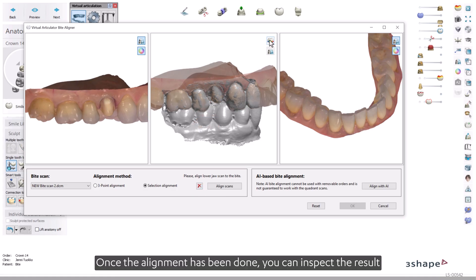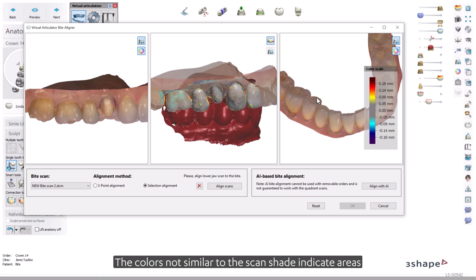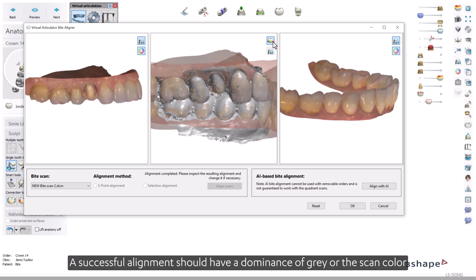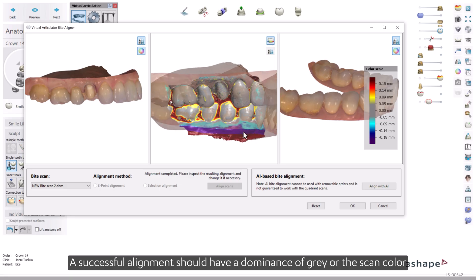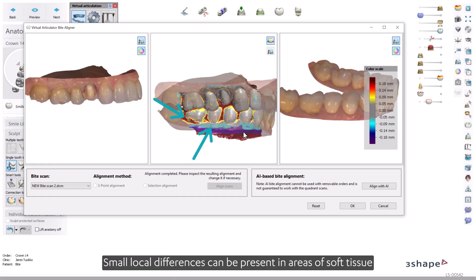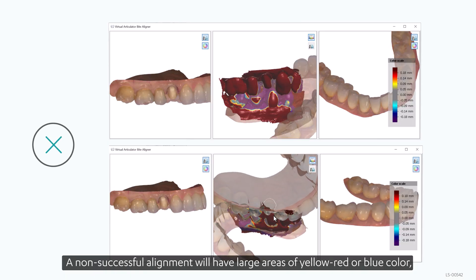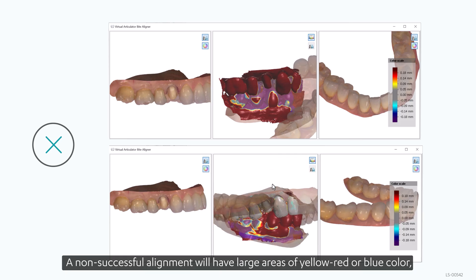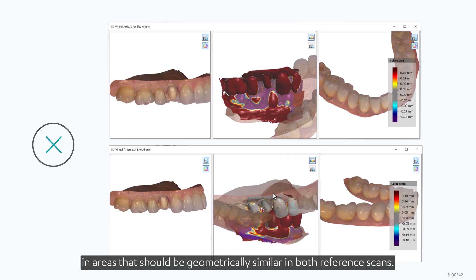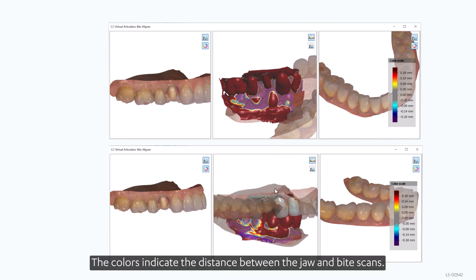Once the alignment has been done, you can inspect the result by turning on the Difference Map tool in the middle window. The colors not similar to the scan shade indicate areas where the scans are not in contact with one another. A successful alignment should have a dominance of grey or the scan color in areas where there is no or very little distance between the overlaid scans. Small local differences can be present in areas of soft tissue or moisture. A non-successful alignment will have large areas of yellow, red, or blue color in areas that should be geometrically similar in both reference scans.